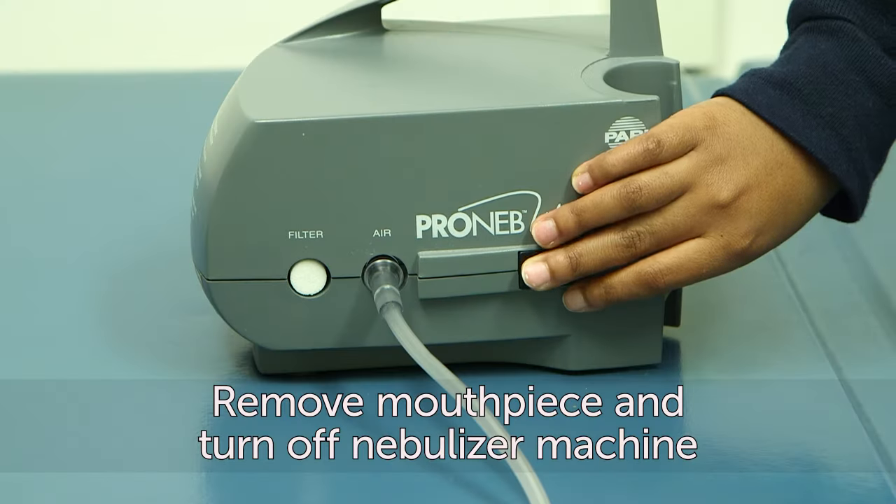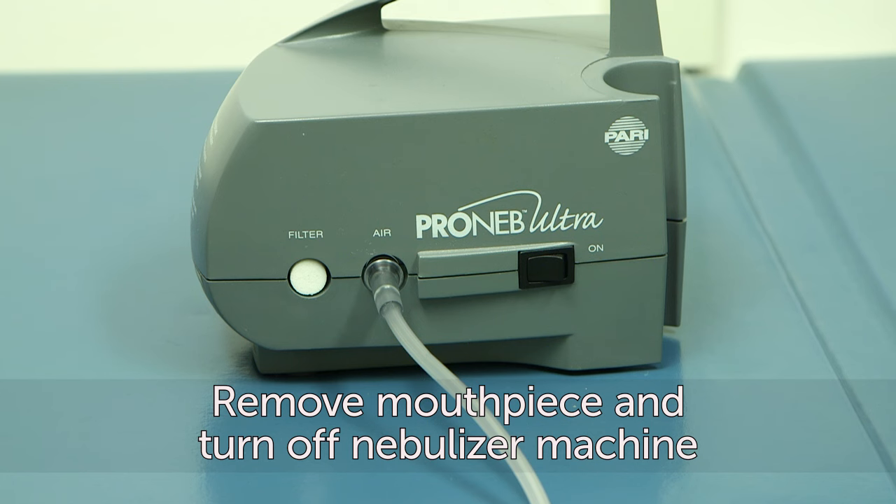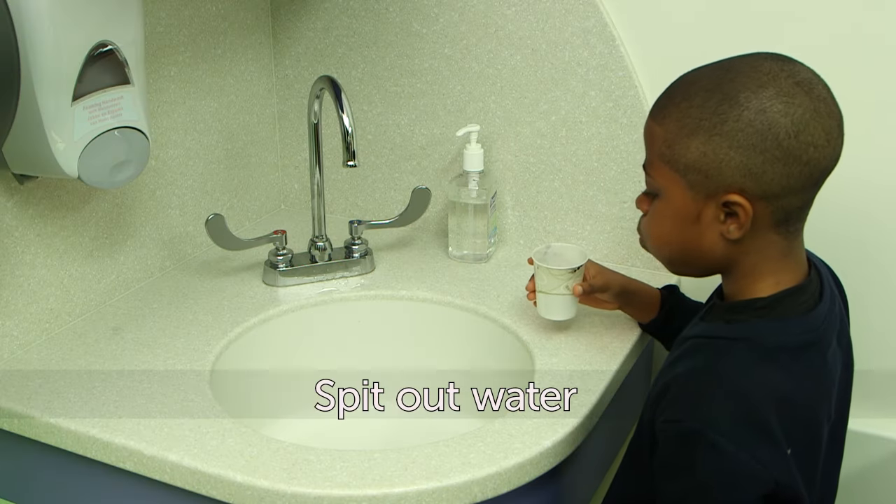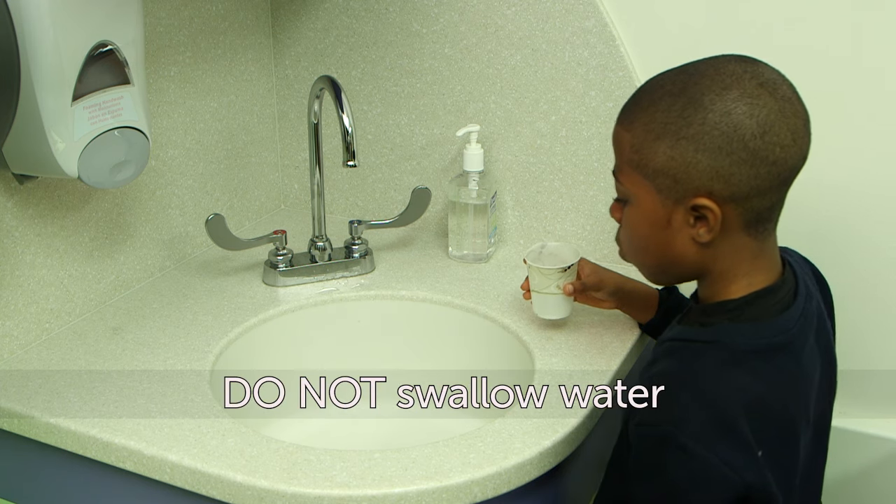Remove the mouthpiece and turn off the nebulizer machine. Rinse your mouth out with water. Be sure to spit the water out — do not swallow the water.